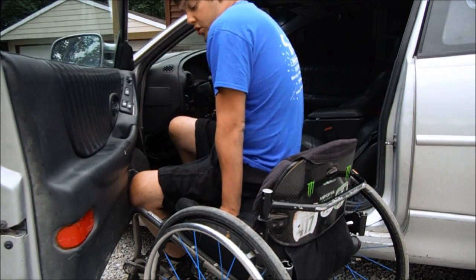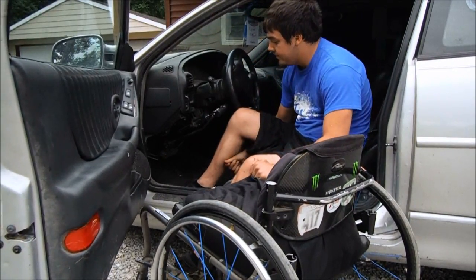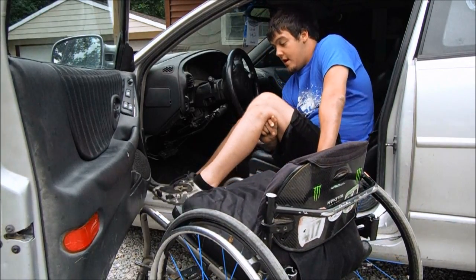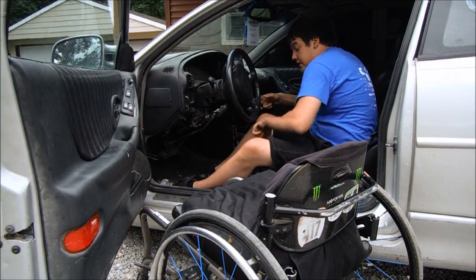In one swift motion, I'll swing over and through the seat — just like that. I'm kind of on the edge, and I've got longer legs, and they catch on my chair. I can just grab it and throw it over here.